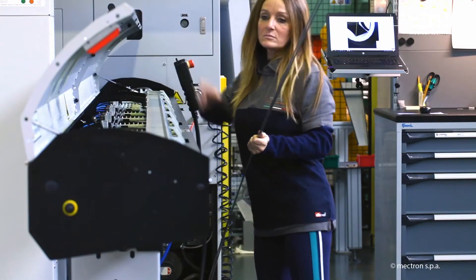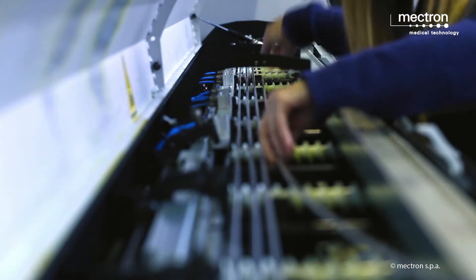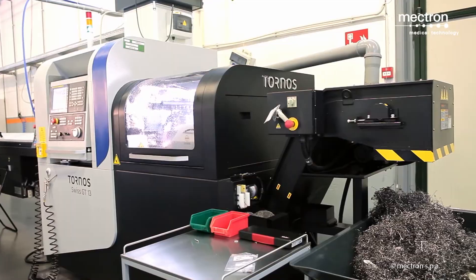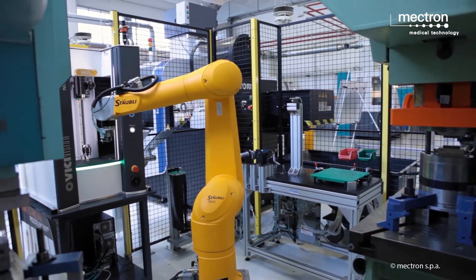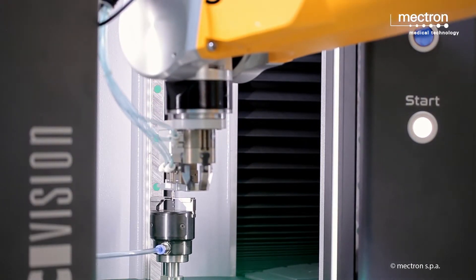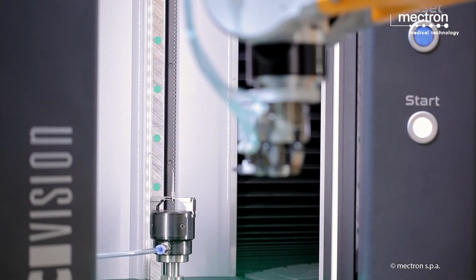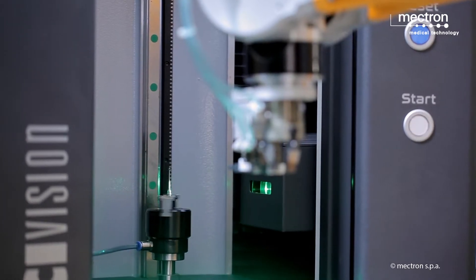The manufacturing process starts by introducing the steel bars into the loader of the milling machine. All rough inserts are picked up by a robotic arm and undergo a first dimensional check using a Visi Vision laser scanning system. Blanks are rejected if their actual dimensions exceed the tolerance.